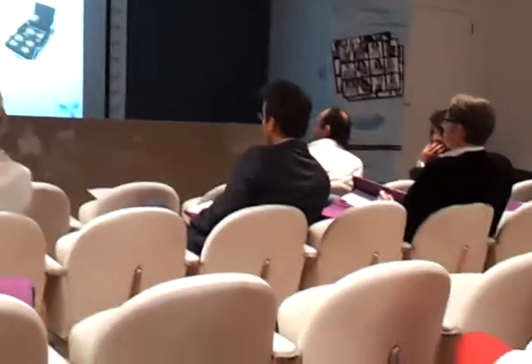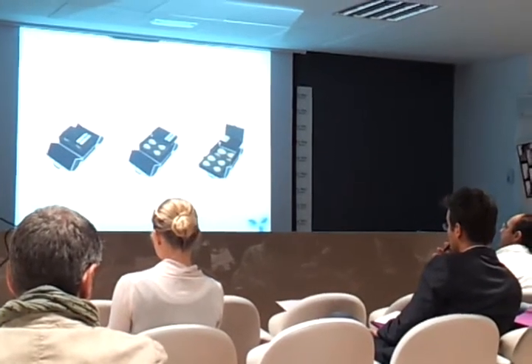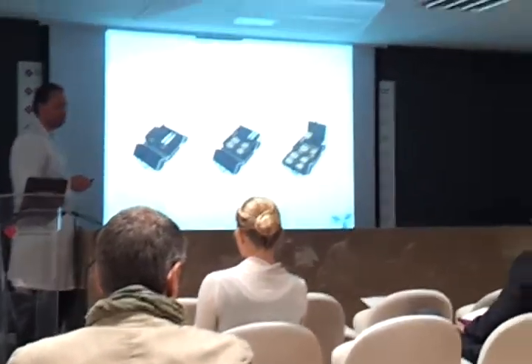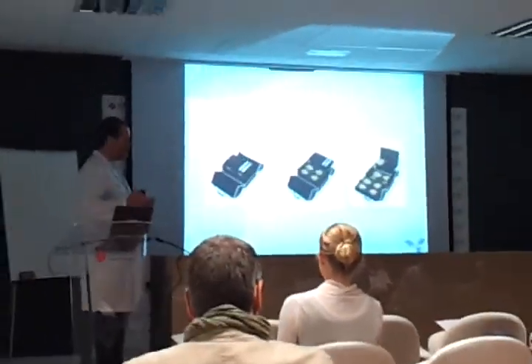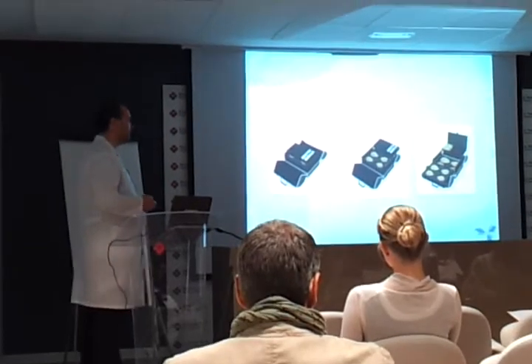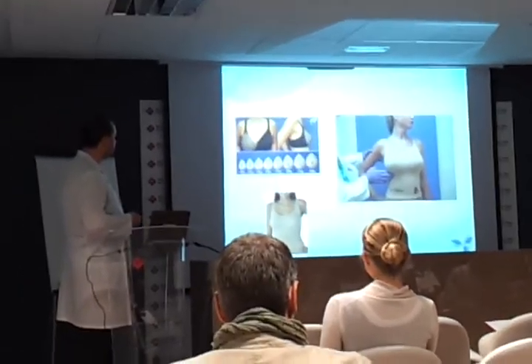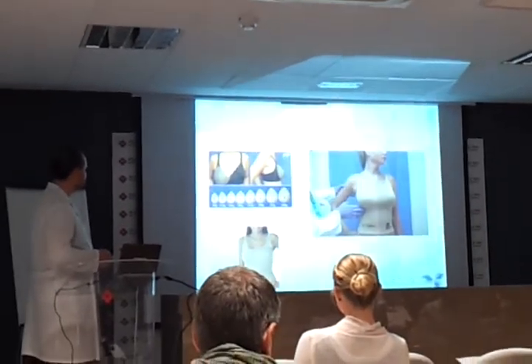They are very useful, especially to convert the surgery. If the patient has some doubts about the result and sees it with the bras, that is the good part of the visit. Let's go to the shop and discuss different options in front of you. It works very well in my office. We have 8 different options from 85 grams to 430 grams.